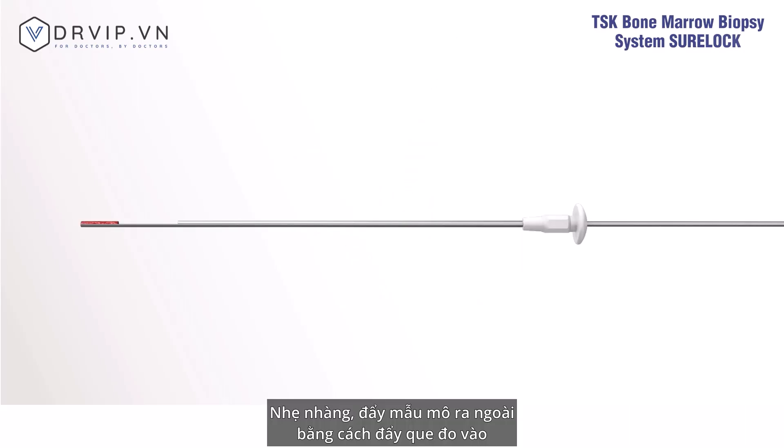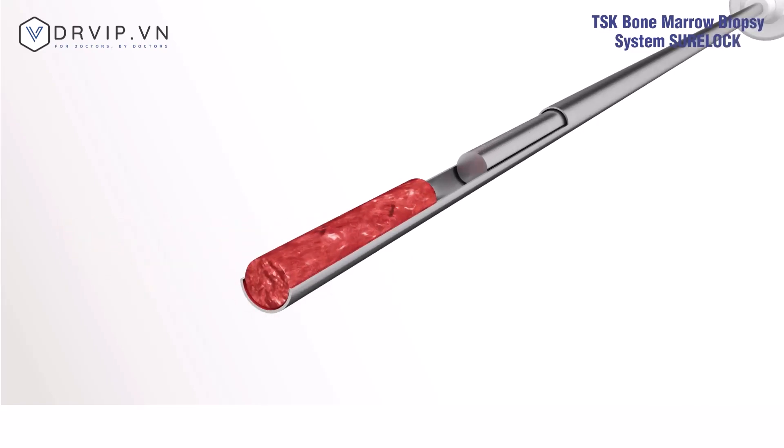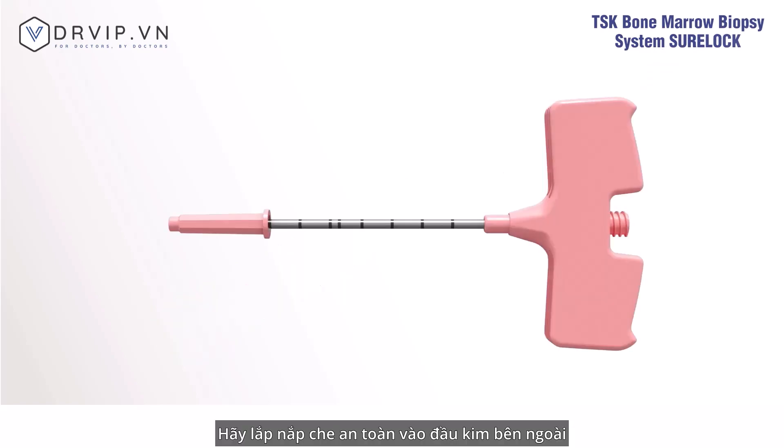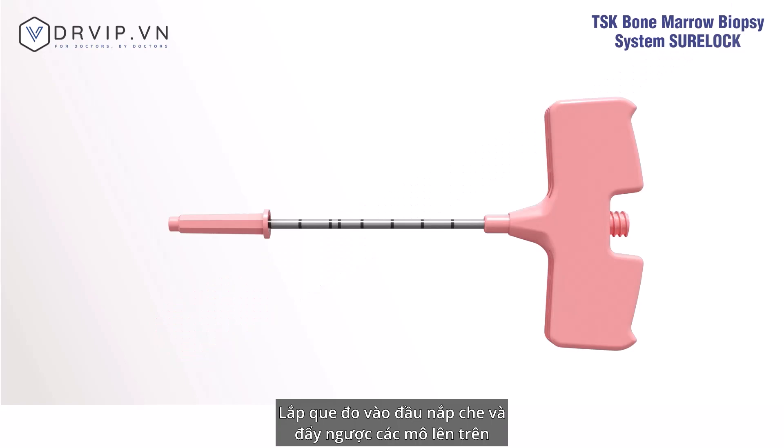Gently push out the tissue by inserting the stick into the end of the Sherlock with the hub. If tissue is left inside the outer needle, attach the safety cap to the tip, insert the stick through the opening, and push out the tissue through the handle.